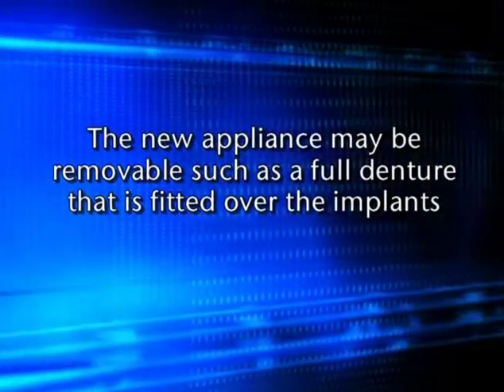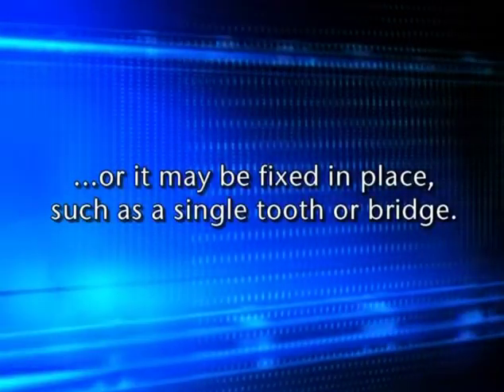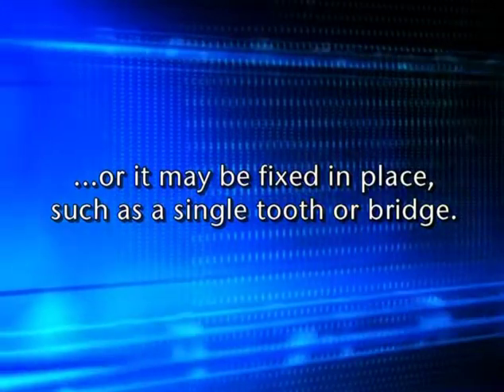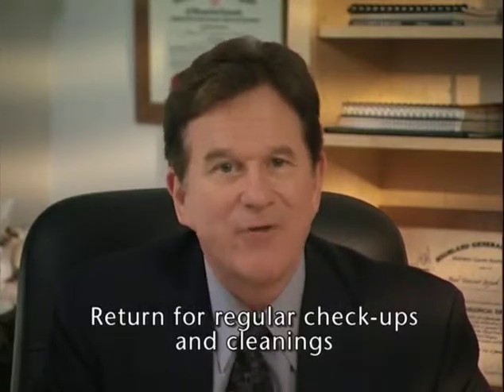The new appliance may be removable, such as a full denture that is fitted over the implants, or it can be fixed in place, such as a single tooth or bridge. The decision to create a removable or fixed dental appliance is determined on a case-by-case basis, depending on factors such as the number of teeth to be replaced. Good oral hygiene is critical to the long-term success of dental implants. The patient must carefully follow the hygiene prescribed by the dental implant team. Now, this includes regular brushing and flossing and returning for scheduled checkups and cleanings.